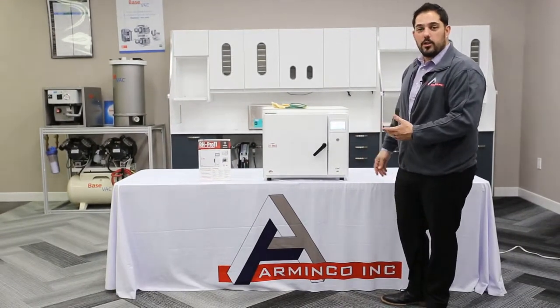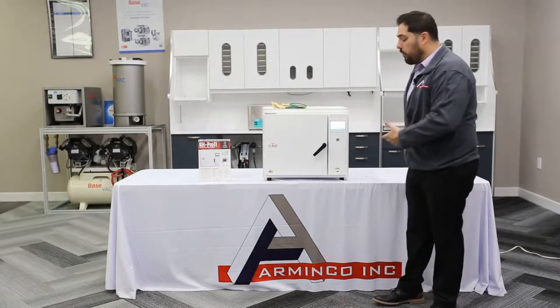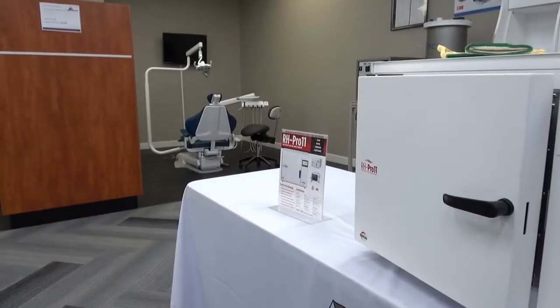Today I'm here to talk to you about the CPAC RH Pro 11. My name is Henry and I'm with Arminco Inc. I wanted to go over a few details, a few specs, and a few options that are available with the CPAC RH Pro 11, which is a waterless sterilizer.